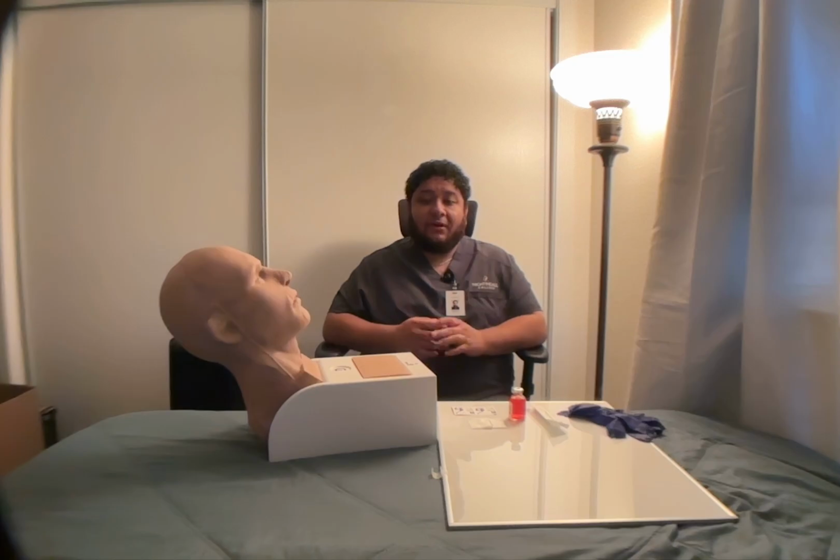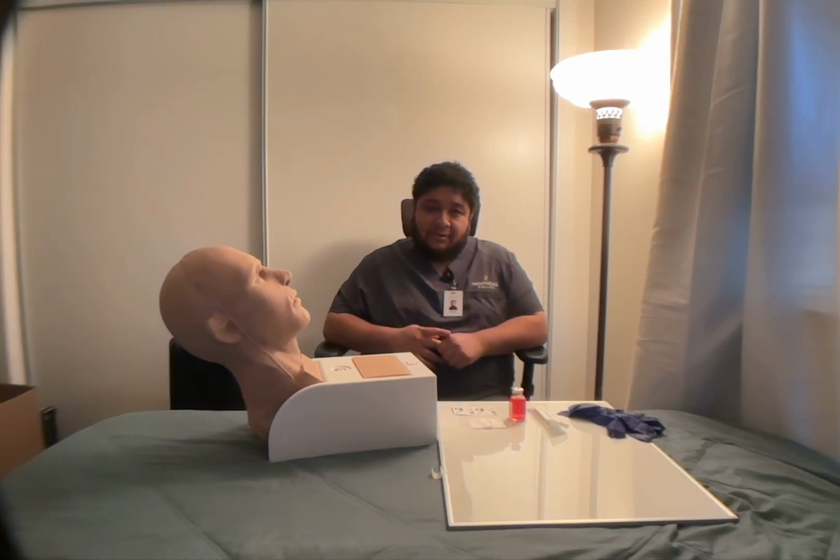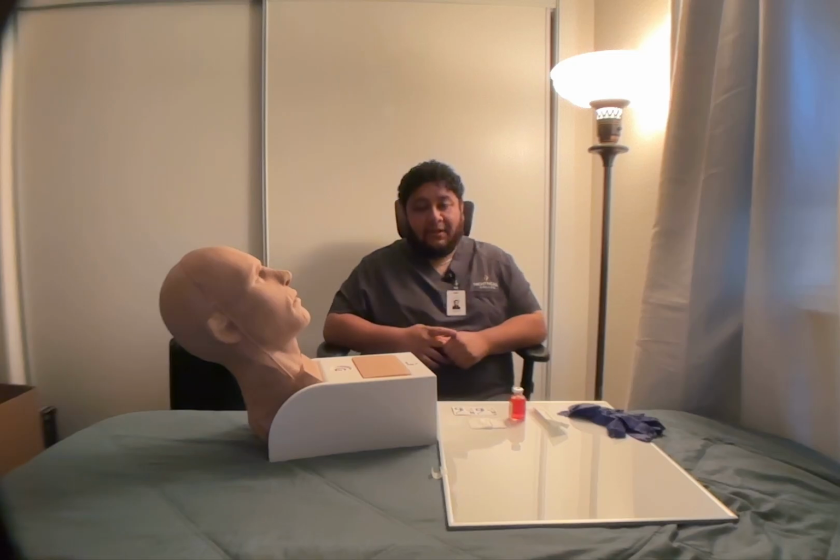Once I'm done verifying all 6 of those, I will go ahead and check the patient's EHR, and I'm going to verify the order in the MAR. And once I verify the order in the MAR, I'm going to read that the doctor has ordered 5 tuberculin units intradermally, which is supplied in 5 units per 0.1 milliliters. So today's dose will be 0.1 milliliters.